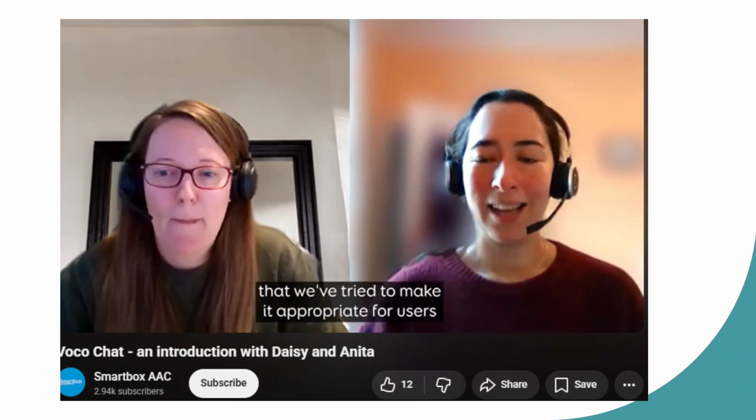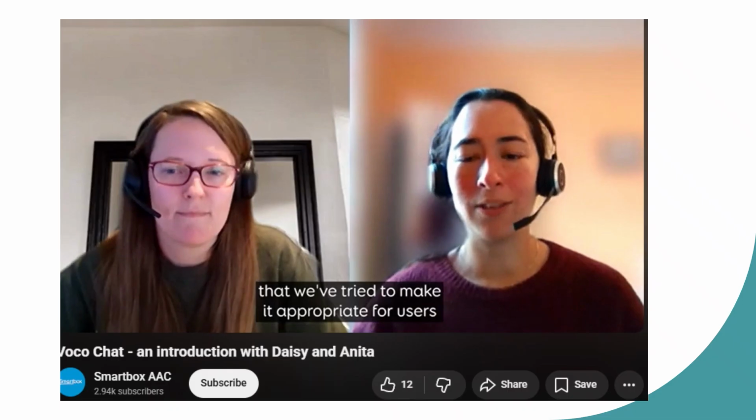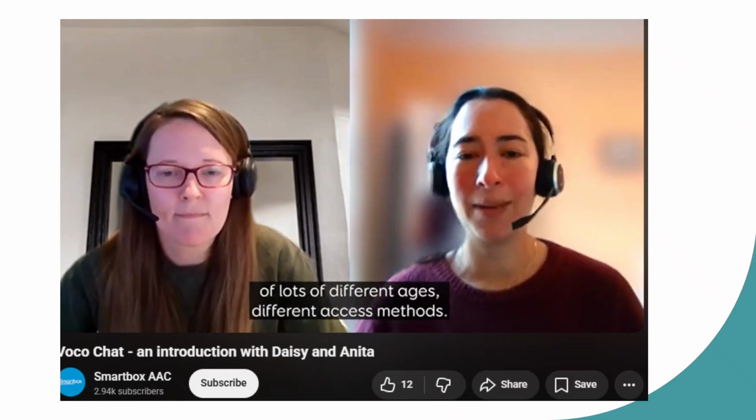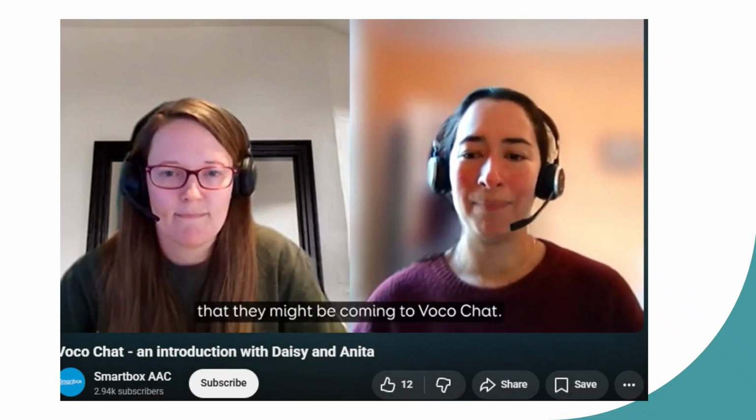And I think it's worth adding that we've tried to make it appropriate for users of lots of different ages, different access methods, and as Daisy said, different reasons that they might be coming to VocoChat.